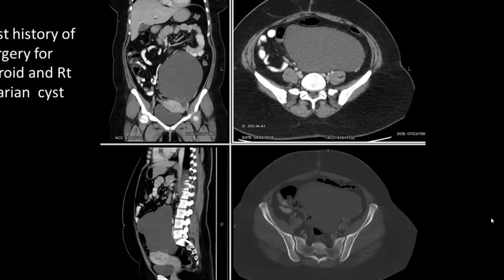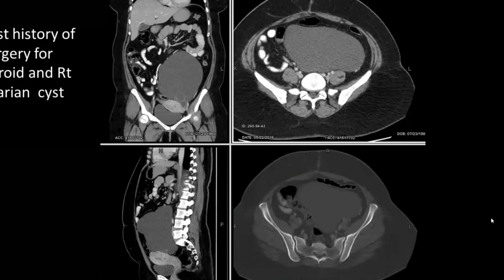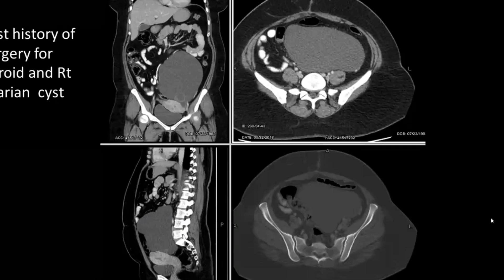Past history of surgery for fibroid and right ovarian cysts. Whenever you see a bizarre-shaped cystic area, whether on ultrasound, CT, or MRI, think of a peritoneal inclusion cyst. If it is elongated with partial septations, think of hydrosalpinx. But if there are no septations, it is very bizarre-shaped, and there is a surgical history, then give the diagnosis of peritoneal inclusion cyst — or include in your differentials both hydrosalpinx and peritoneal inclusion cyst.